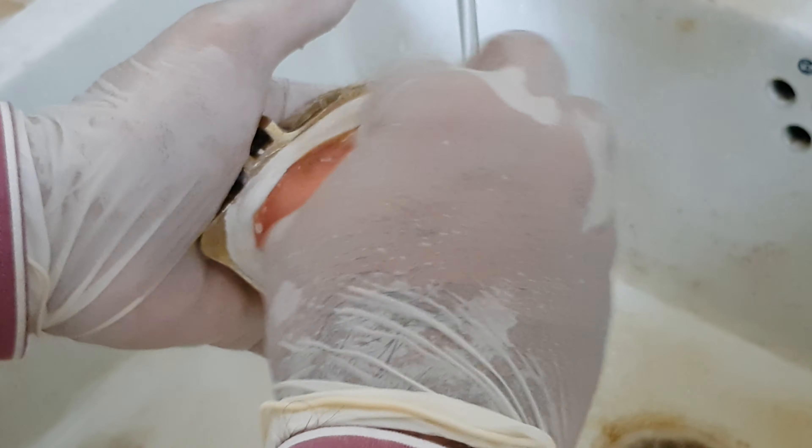You must make sure to remove as much excess plaster as possible from the wax pattern. After this is done, smooth it up again under running water with damp cotton, making the wax pattern and the investment as smooth as possible. Keep it as clean as possible — the neater it is, the neater your curing process will be. Your wax pattern has to be very neat, and similarly your flasking process has to be neat.